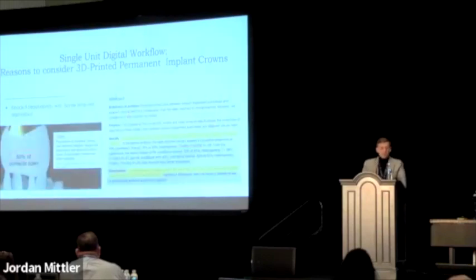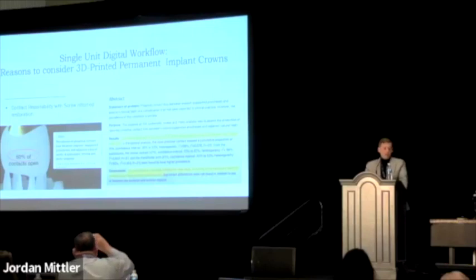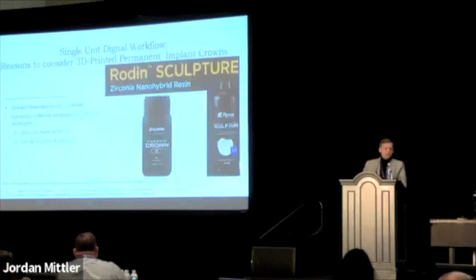Another really interesting concept is a review from 2021 showing that 50% of implant crowns can develop open contacts, right? Particularly in the lower arch, on the mesial contact. So that could be a big problem if we want to maintain proper gingival health and patient comfort. And the nice thing with a screw retained resin crown, in under 5 minutes, you can unscrew it, bond it, put a little composite, polish it, put it back in, good as new, right? So our ability to adjust and repair is greatly improved.